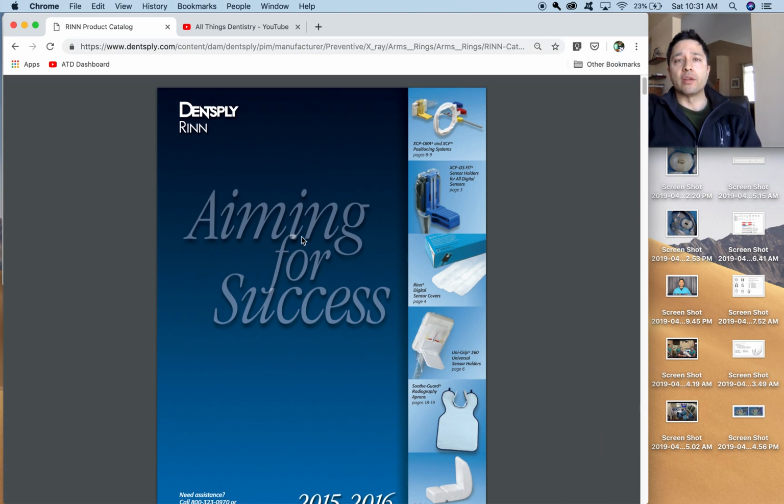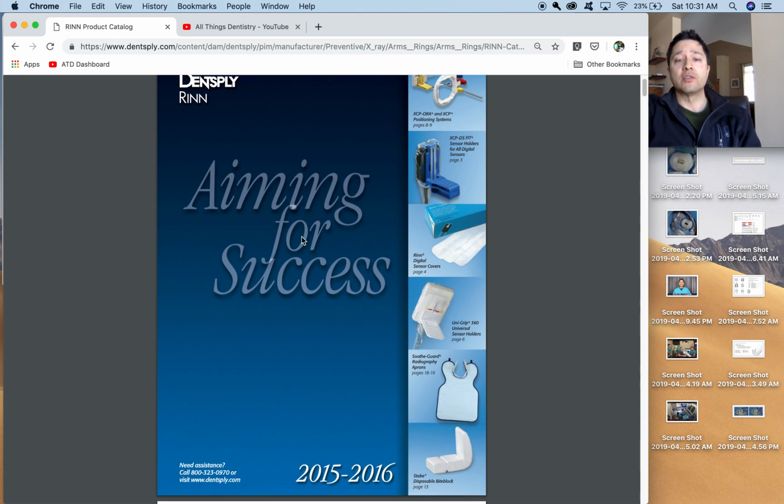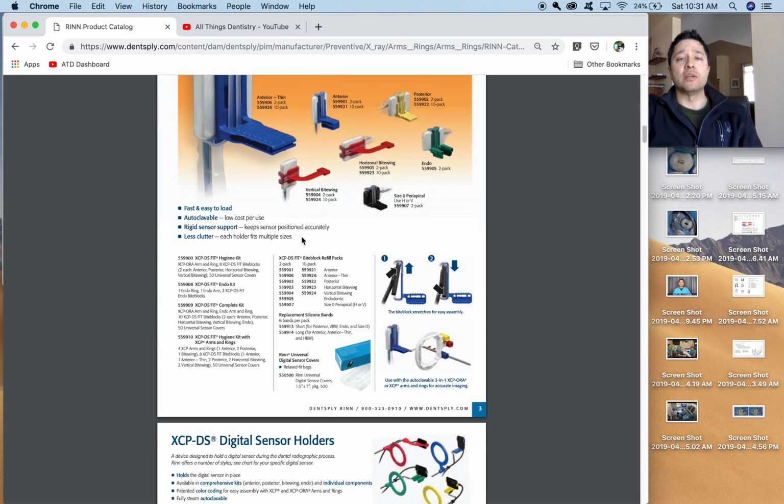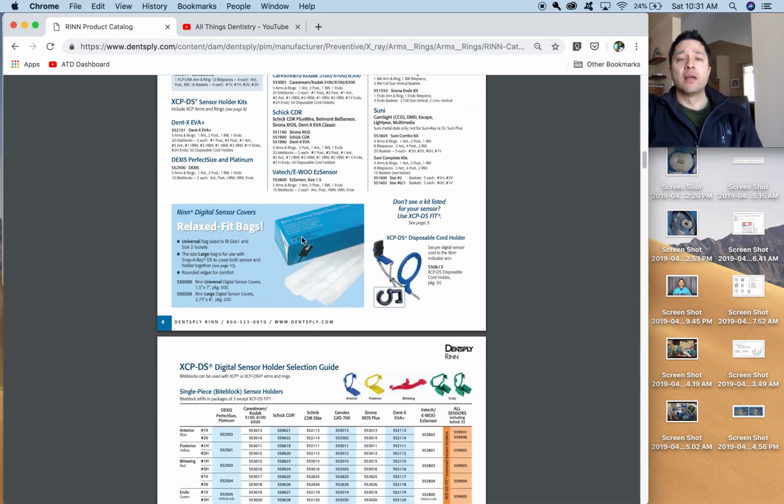This is the Dentsply Rinn catalog from approximately 2015. You can see it there. Dentsply was purchased by Sirona recently, and they've changed their website, so it's a little more complicated. But this just gives you at least the serial numbers of the pieces I was using.